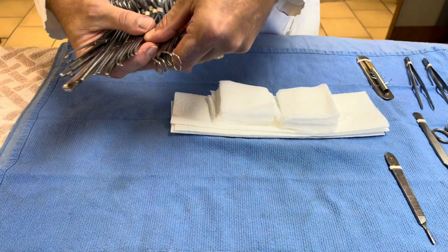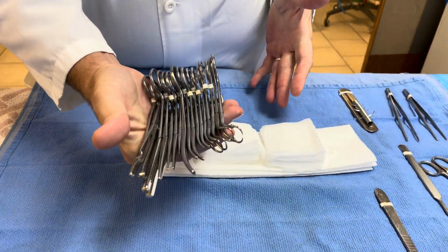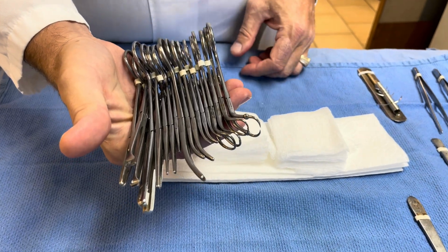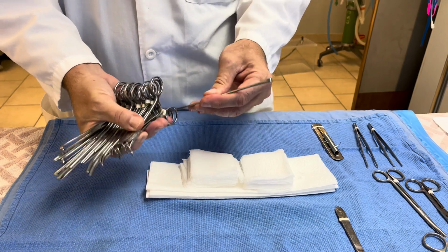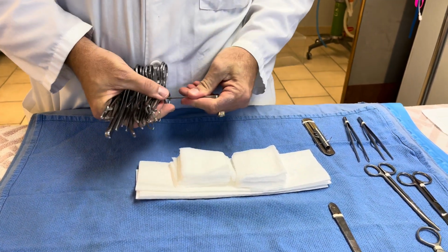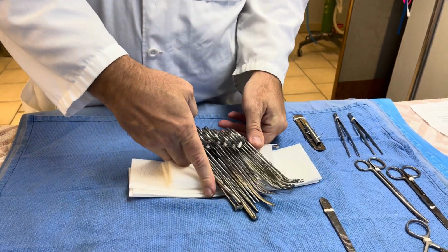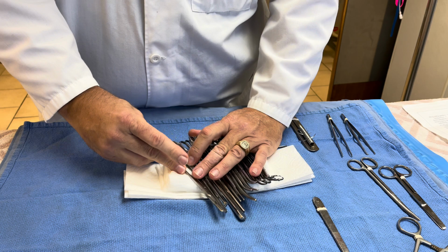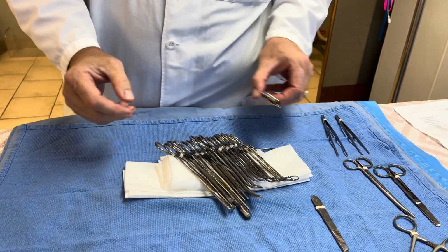And then, last but not least, if your hands aren't as big as mine, a different finger probably works, okay? Then you'll take your spay hook and you'll just pop it through where your pinky finger is, okay? And pop the pinky finger out, obviously. And then everything lays right in there nicely and organized, okay?